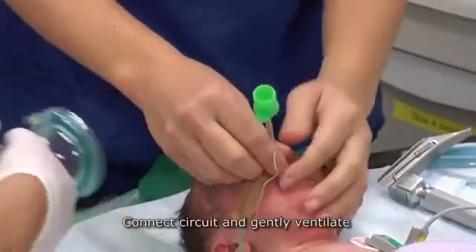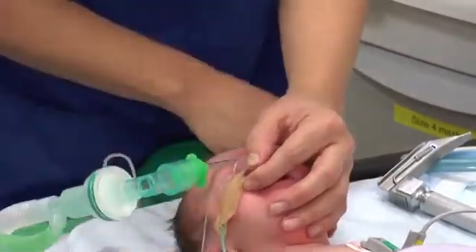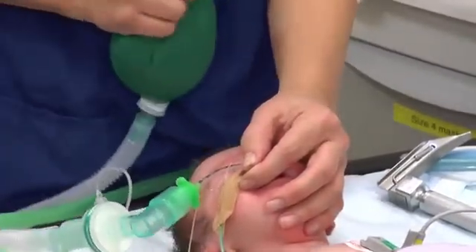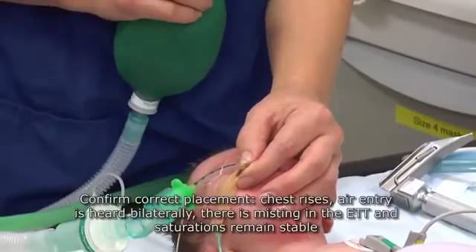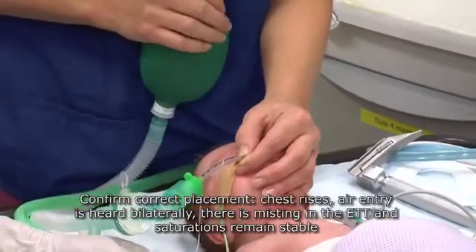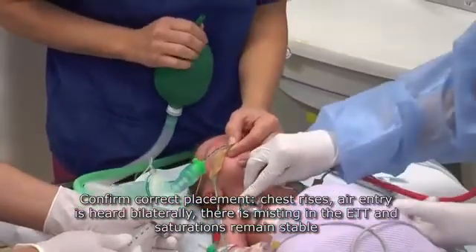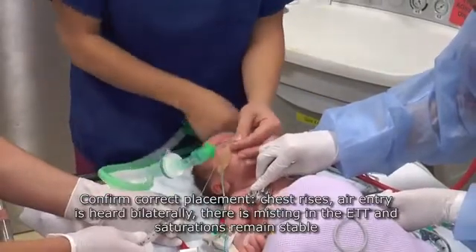Connect the circuit and gently ventilate. Confirm correct placement: chest rises, air entry is heard bilaterally, there is misting in the endotracheal tube, and saturations remain stable.